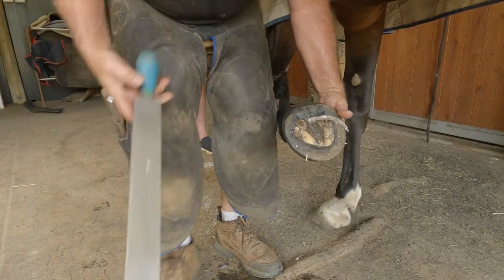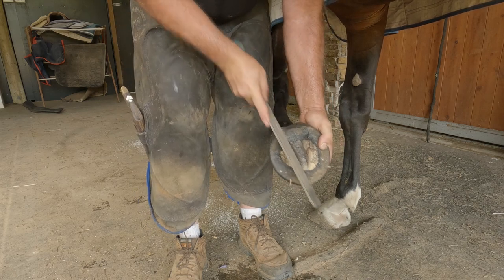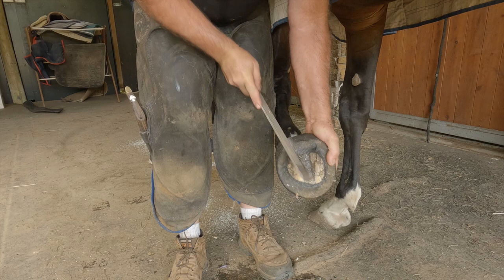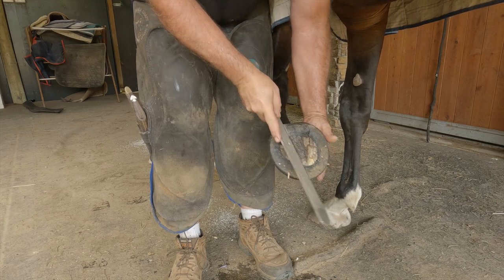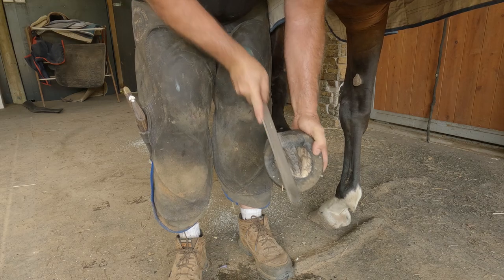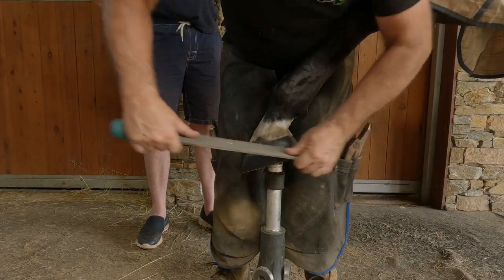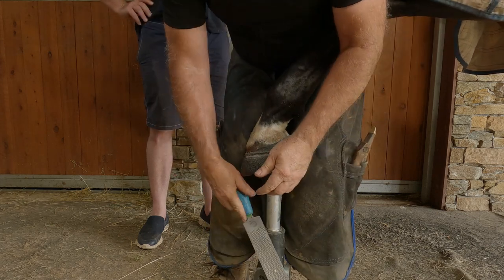Once the cast has dried, I cut the back out of it to allow for expansion of the hoof. If this was a more severe case of laminitis, I would most likely leave the cast intact and protect the soft tissue in the back of the foot with dental impression material. I don't like the cast being too close to the coronary band, so I remove it, ensuring I have a good amount of clearance.